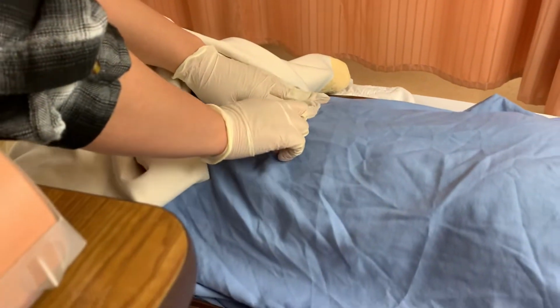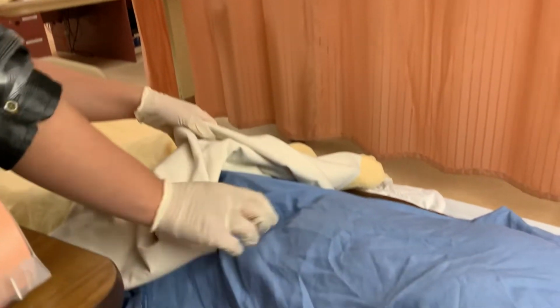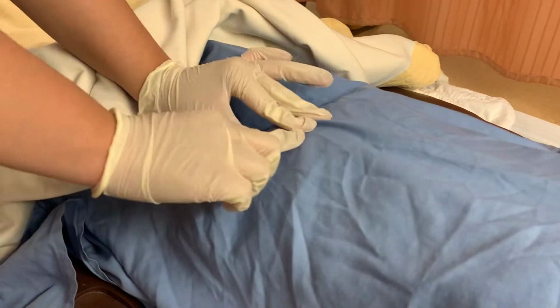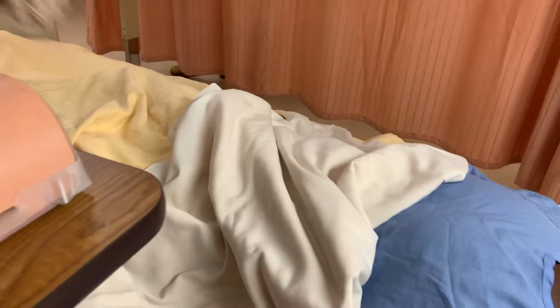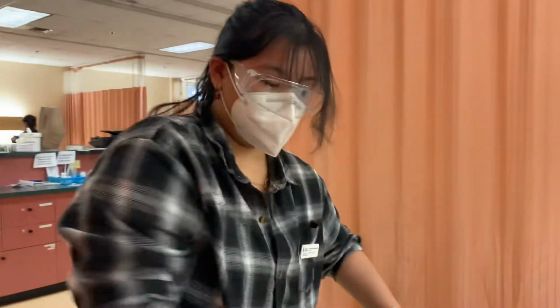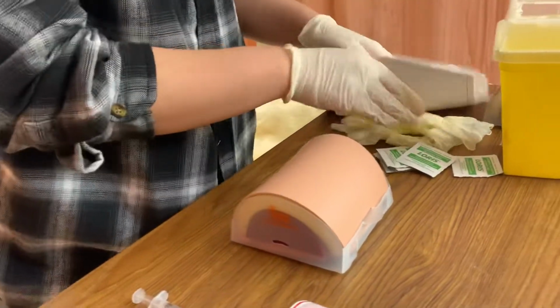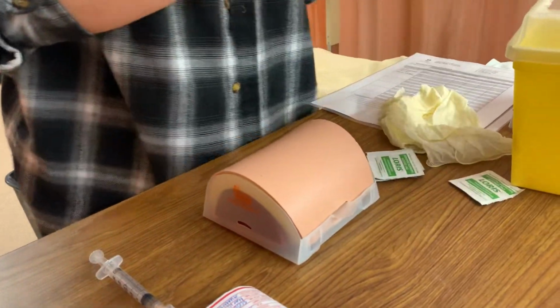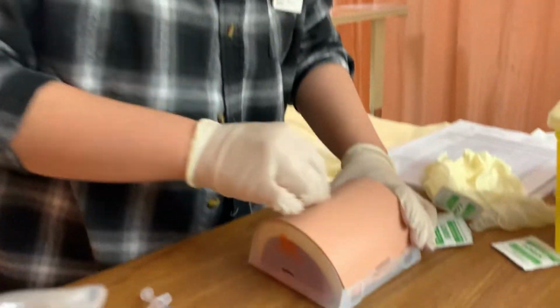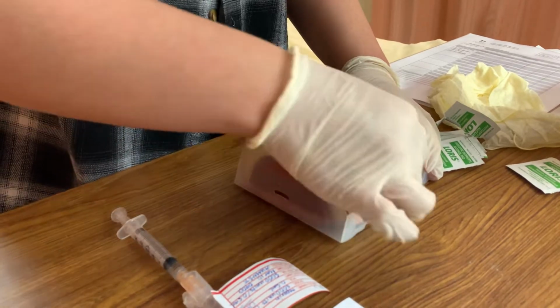So let's say your umbilicus is here, and I'll be injecting it just at the side here at your abdomen to make sure I get to that fatty layer. So right here, right beside. So your umbilicus will be right here. I'll probably inject right here. Okay. So now that I have that ready, I'm going to wipe the area in a circular motion. I'm also gonna let that dry.